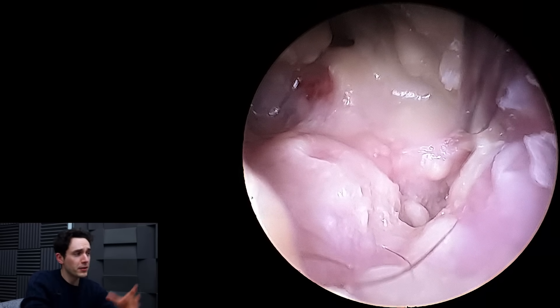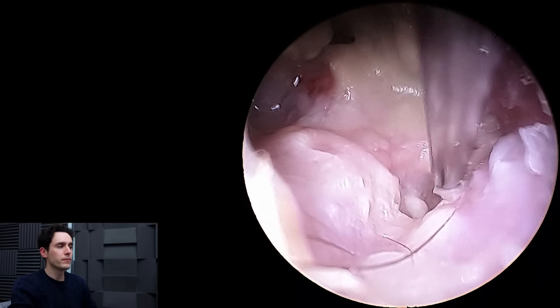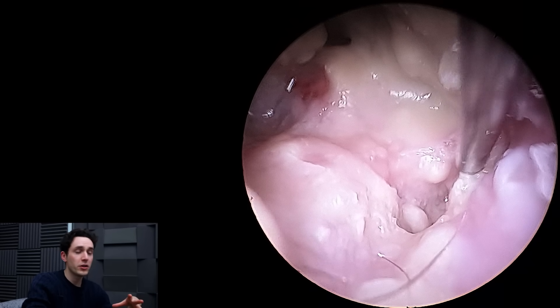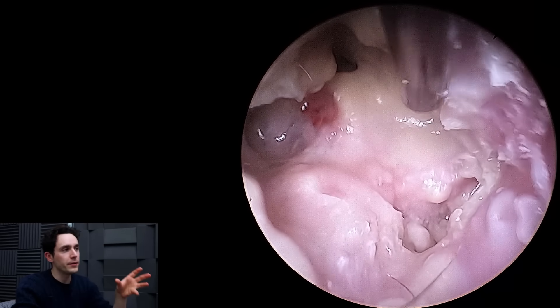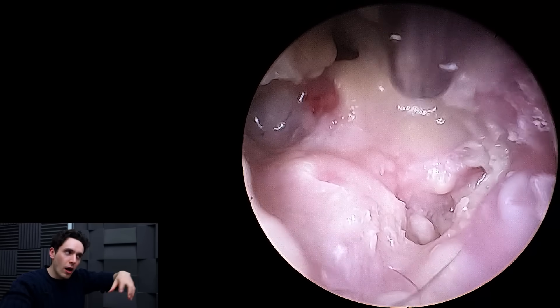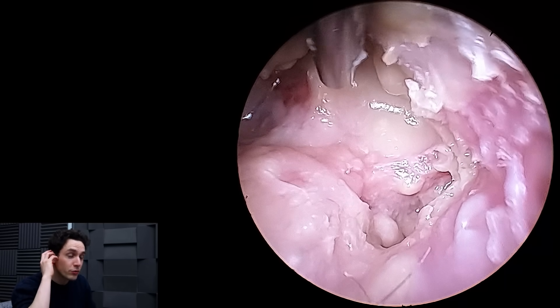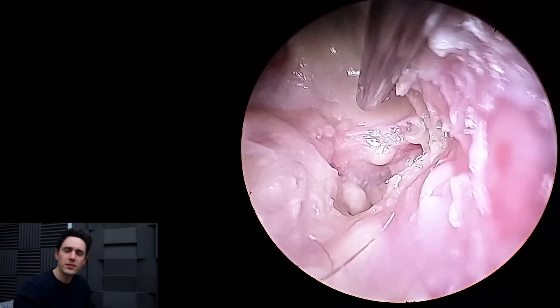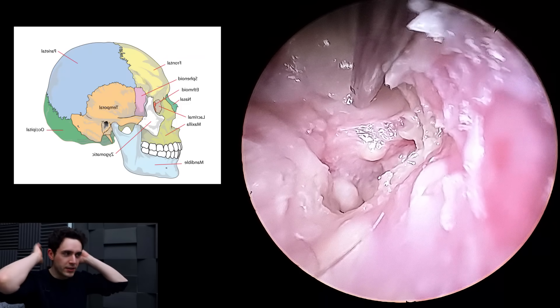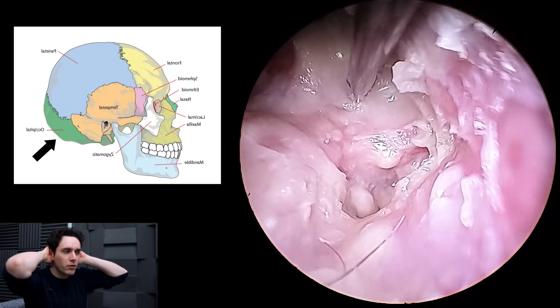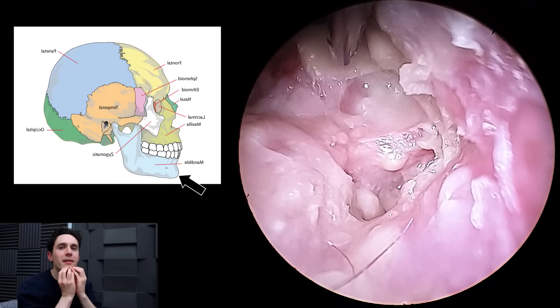And it's a mastoid cavity. Now that's a little bit more difficult to explain if you've not watched a lot of these videos before. Essentially a mastoid cavity is where a surgeon — a particular specialist type of surgeon or ear nose and throat surgeon — has gone in and basically artificially enlarged the ear canal by drilling away some of the mastoid bone.